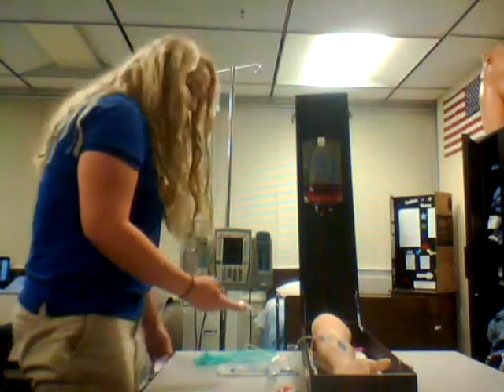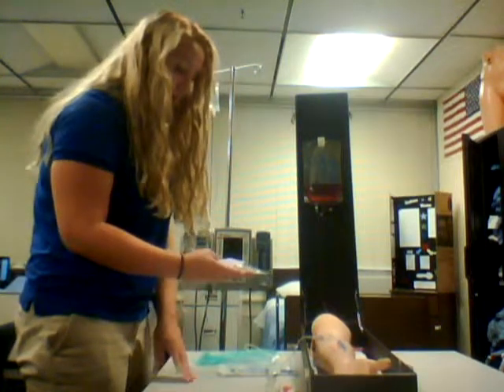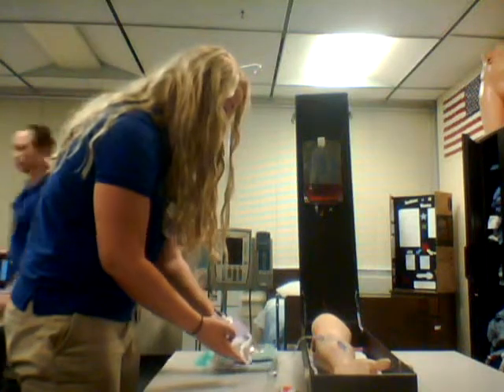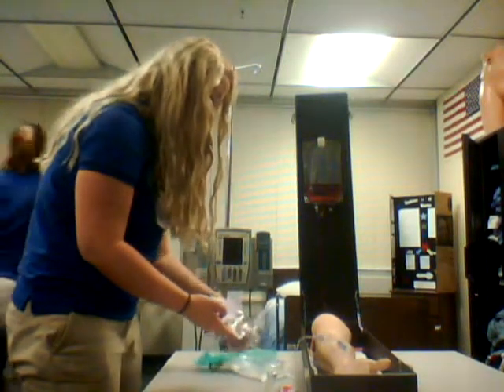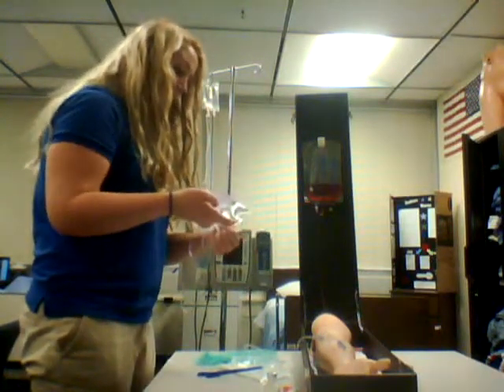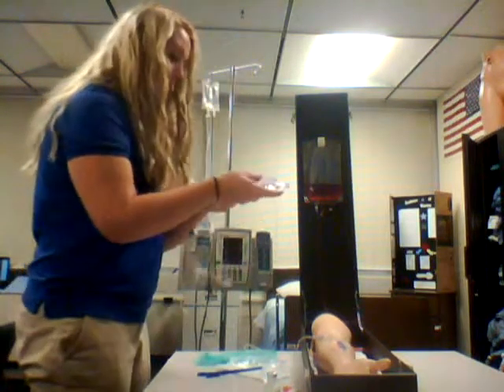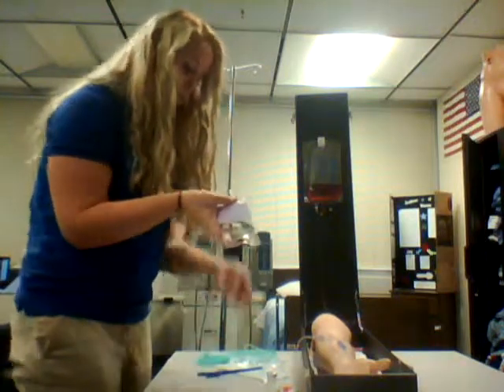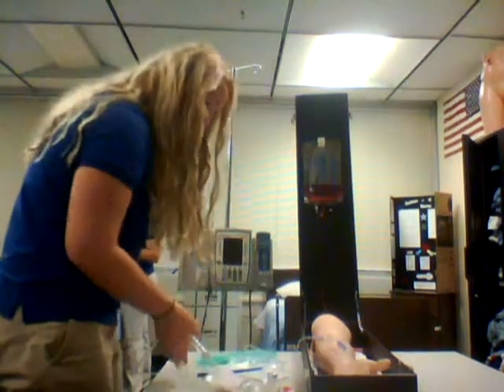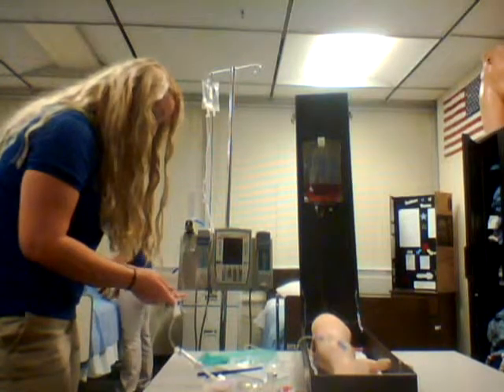And I'm going to apply a label onto my bag with the client's name, the drug, the route, the timing, and my initials. And I'm going to take my tubing and attach the needleless device to my bag. I'm going to make sure that it is clamped off. I'm also going to put a label on my tubing with the time, date, initials as well.